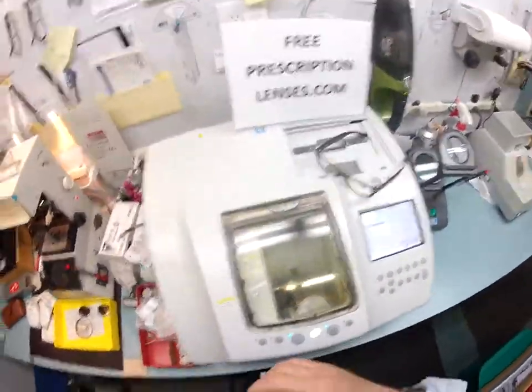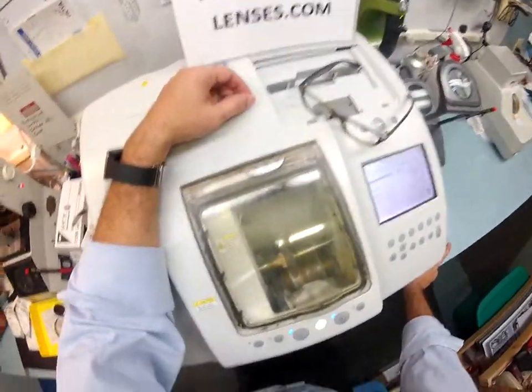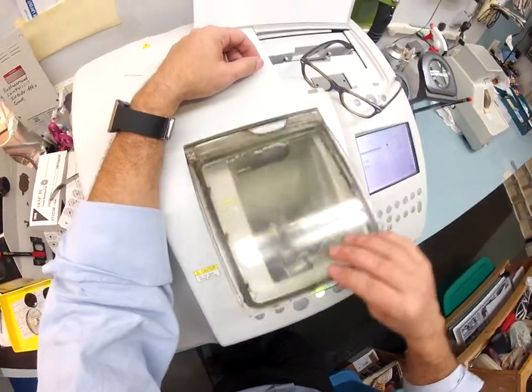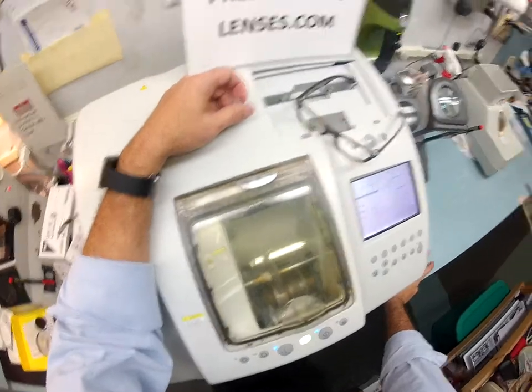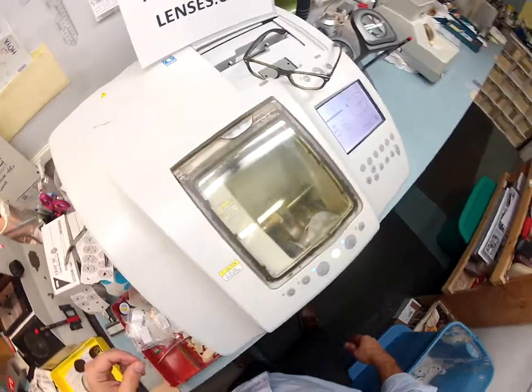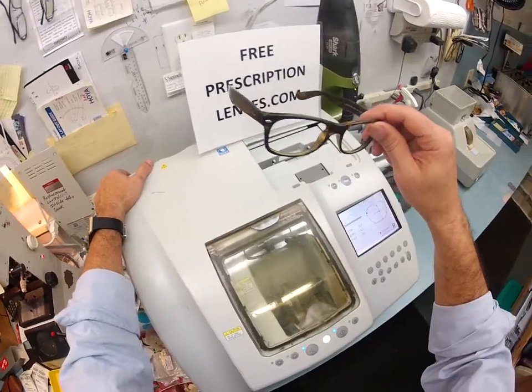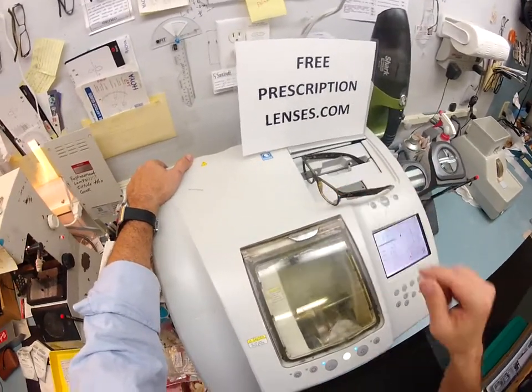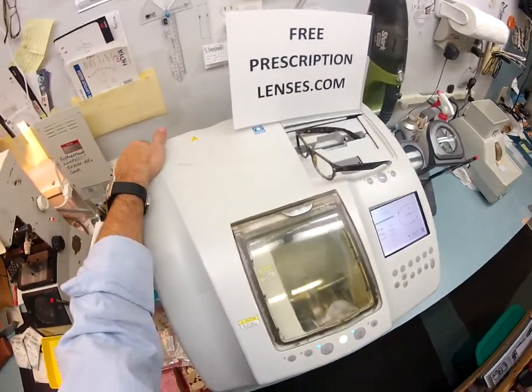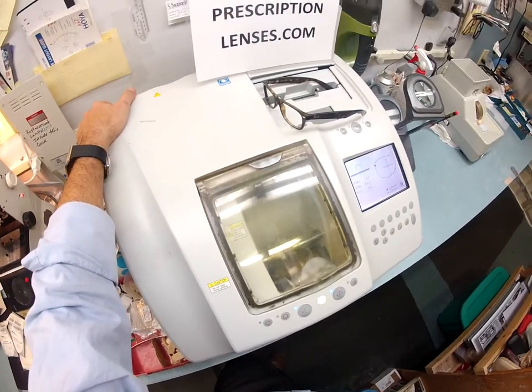Your polycarbonate lenses are 40 percent thinner and lighter than regular plastic, virtually unbreakable, and even bulletproof up to 22 caliber. They have both UVA and UVB protection. Here at freeprescriptionlenses.com you buy the frame from me and get free single-vision lenses — at least 99% of the time. If you have a very high power I'll give it to you at my cost. You paid the upgrade to the transition, and that was it.